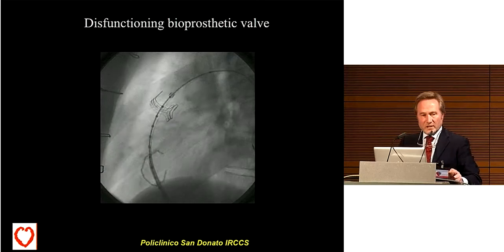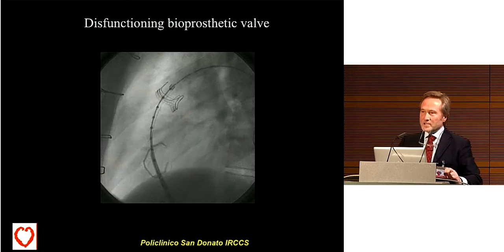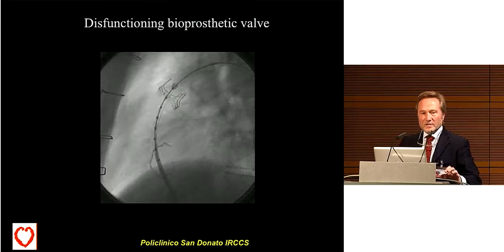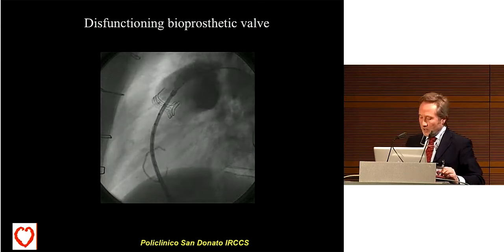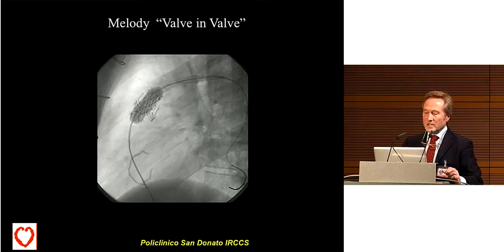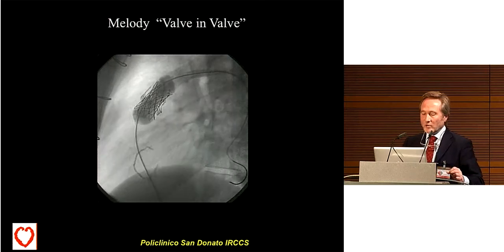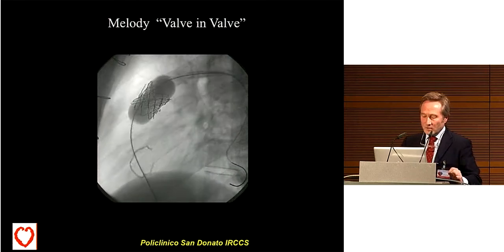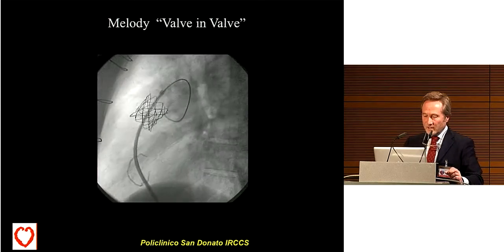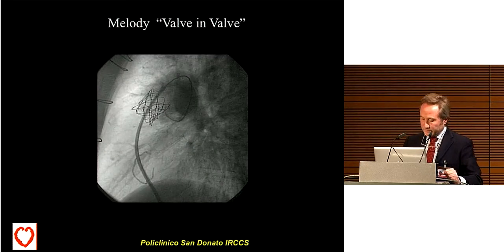Bioprosthetic valves as well can be treated in the cath lab when they malfunction. Actually, it's even easier because we have a rigid landing zone, and we don't need to do prestenting in this case. This is a Melody implanted in a procedure that we may call valve-in-valve. You see the inflation, full expansion of the valve, and immediate results showing a perfectly competent valve.